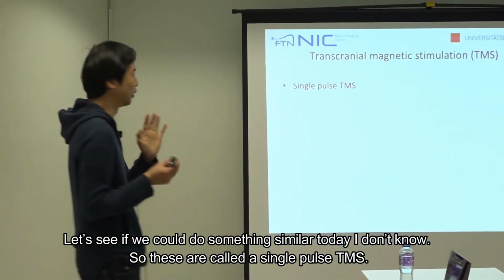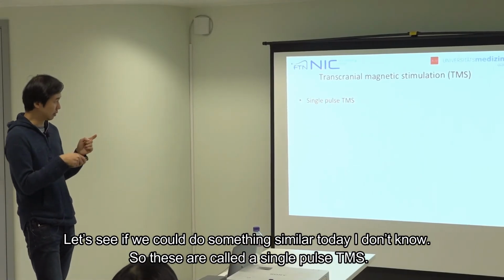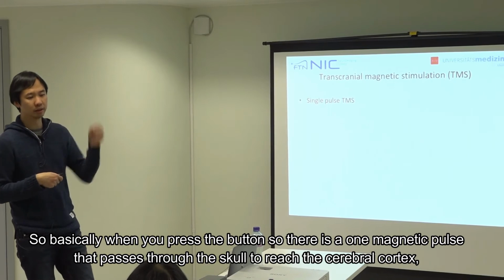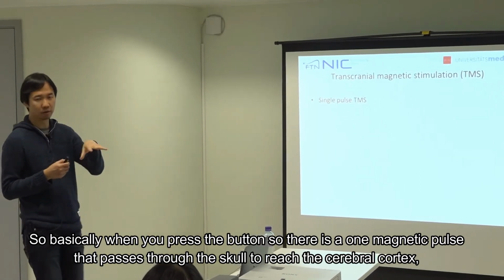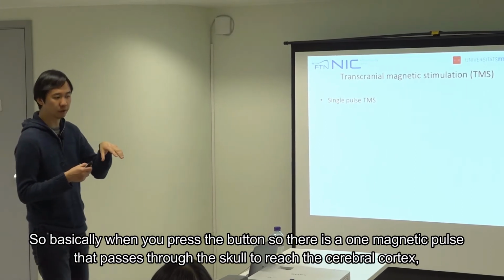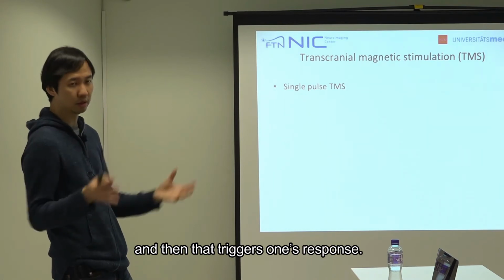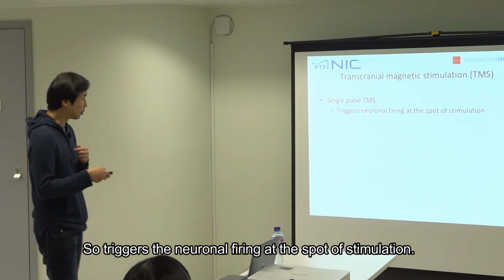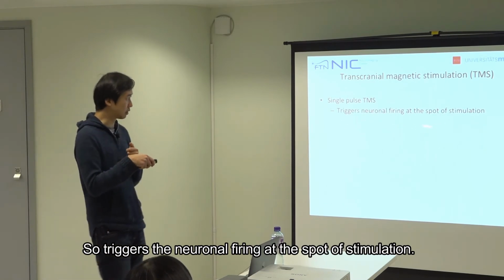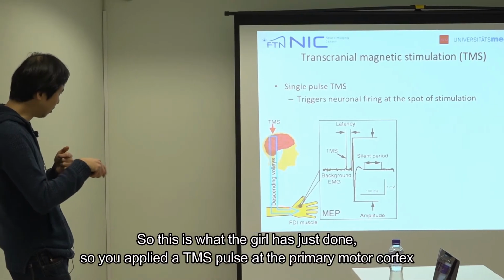So these are called single pulse TMS. Basically, when you press the button, there is one magnetic pulse that passes through the skull to reach the cerebral cortex, and then that triggers one response. Okay? So it triggers the neuronal firing at the spot of stimulation. So this is what the girl has just done.